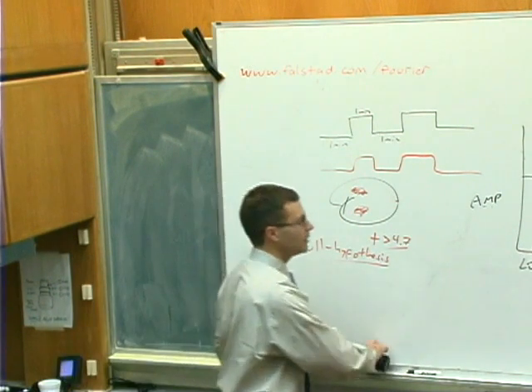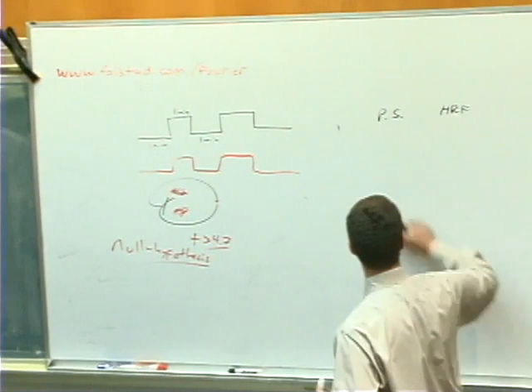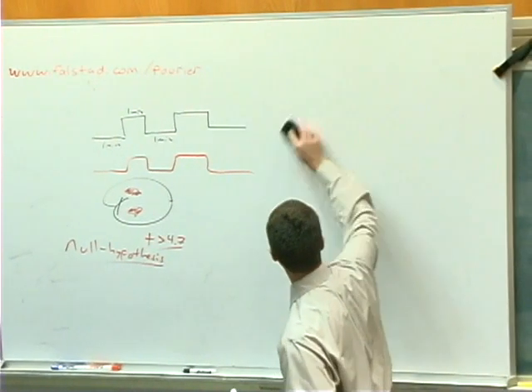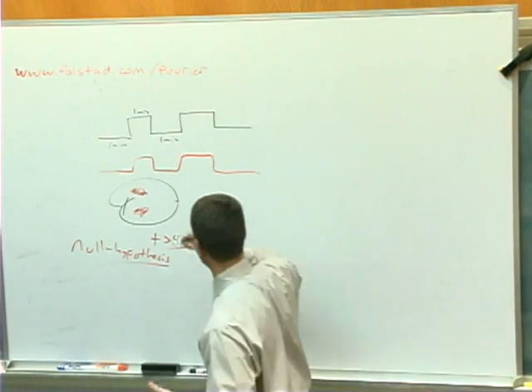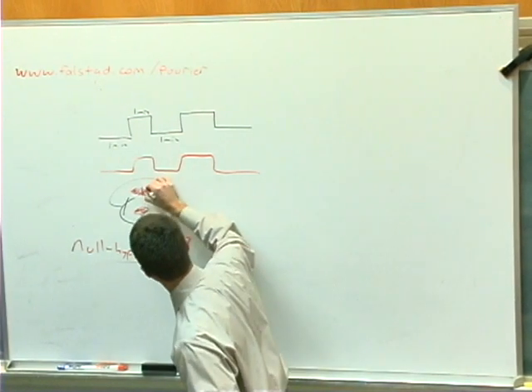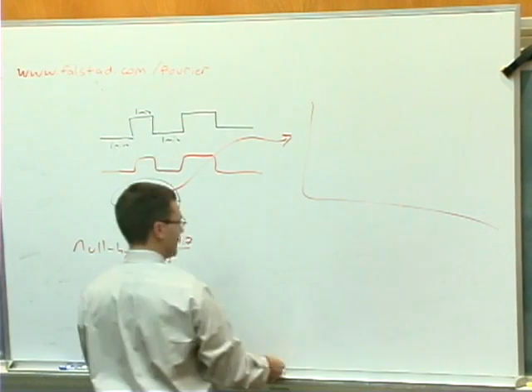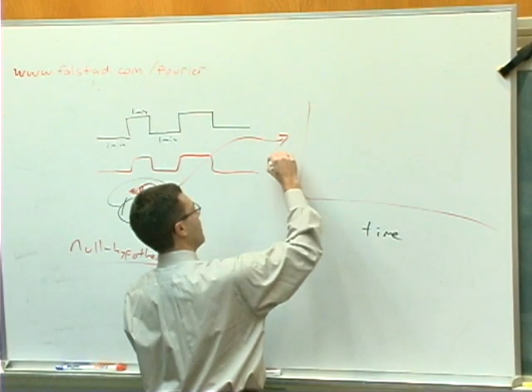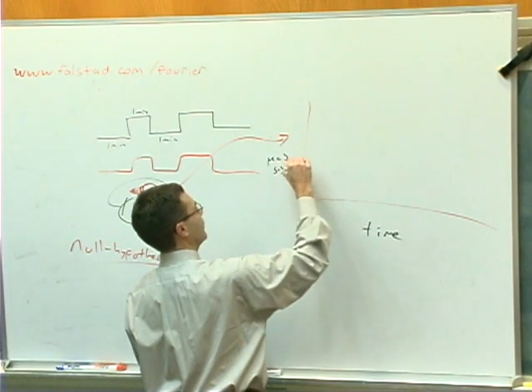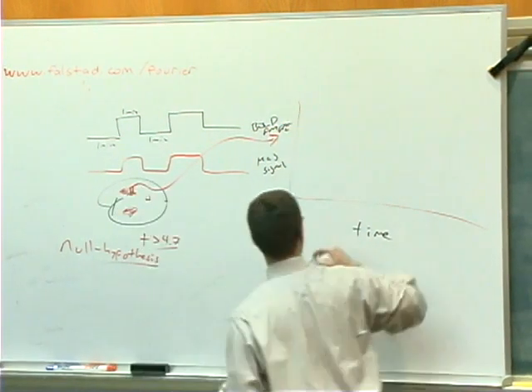Step one to trying to figure this out is you start taking a look at the data from any one voxel in the brain. So you just plot the data. Let's just pick a voxel here, and make a graph, and plot the data over time. This is time, and this is the magnitude of the signal. So this is just the BOLD fMRI signal over time from that voxel. And it looks something like this.